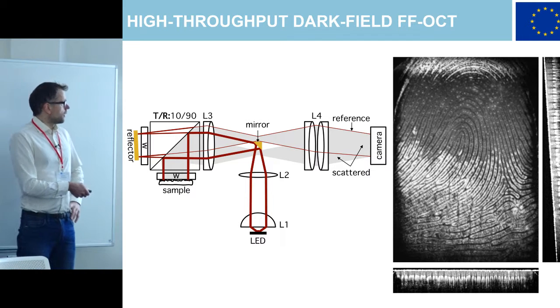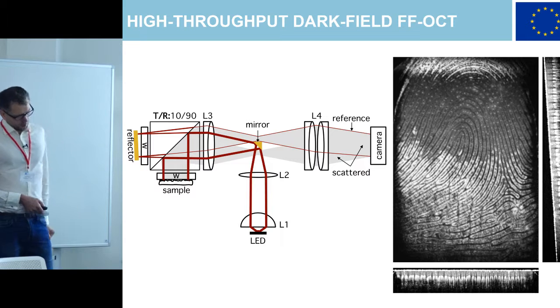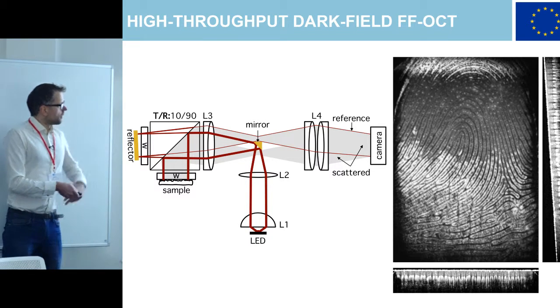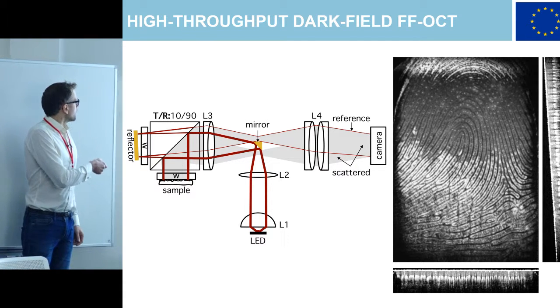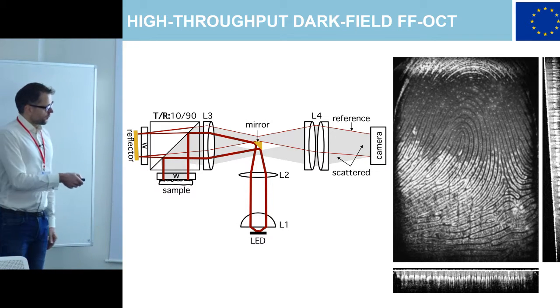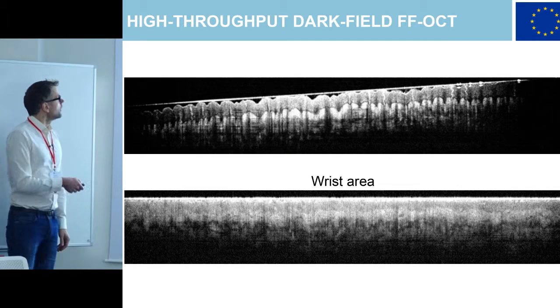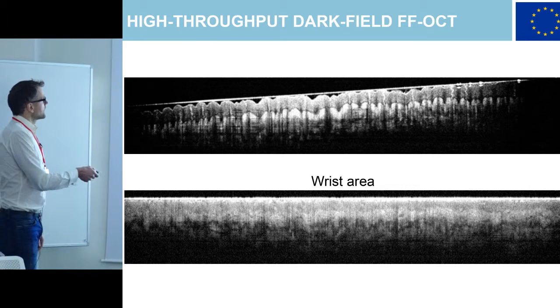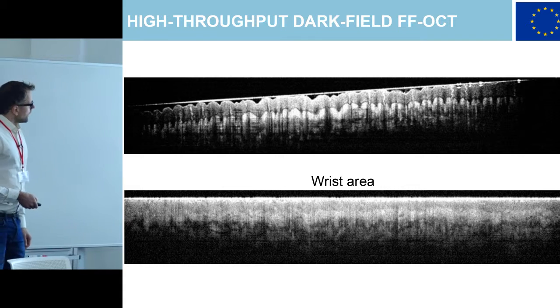These are examples of images that you can acquire when you progressively go deeper. And as I said, these are acquired at an angle because I didn't use the grating here, but a tilted mirror. If you look from the side, you can also see axial images. There's a lot of things happening there. You see external fingerprint, internal fingerprint, and some capillaries going up, some blood activity.